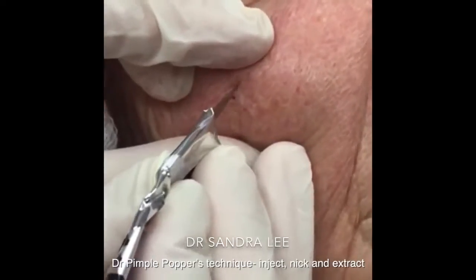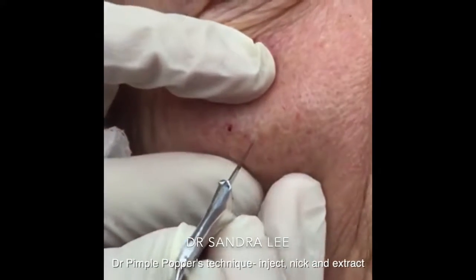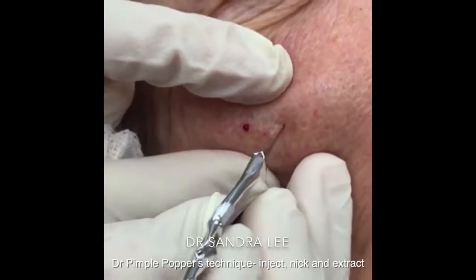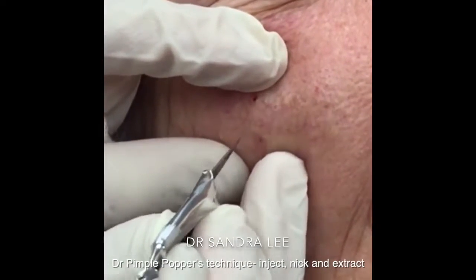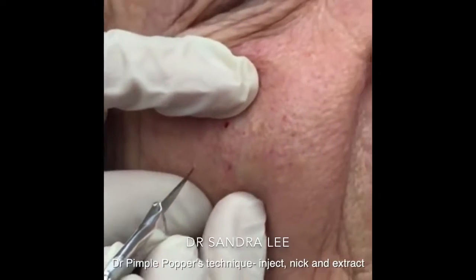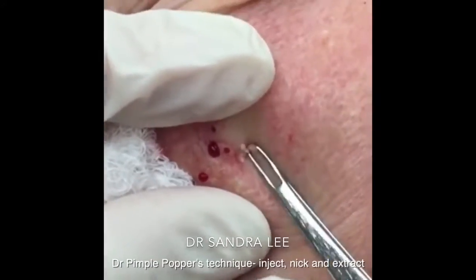On the skin here. Sometimes you might feel a little poke. Are you on aspirin or a blood thinner? I am. Yeah. Aspirin. That's what can cause you to kind of maybe bleed a little bit more. But that's normal and it's nothing harmful. And see if I can get some of these down for her.